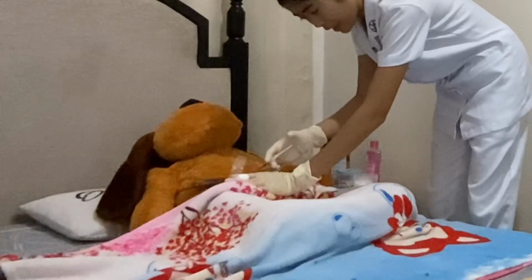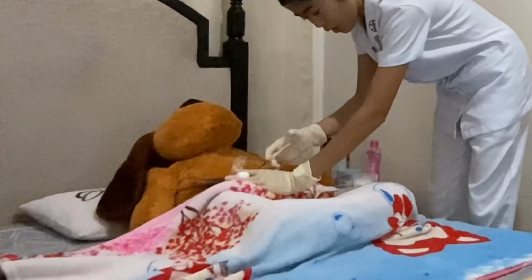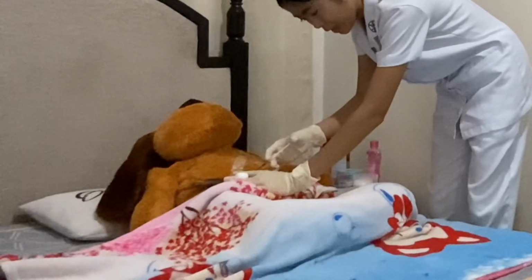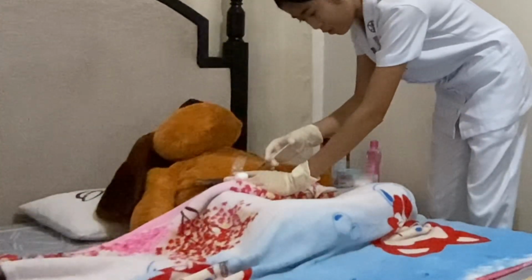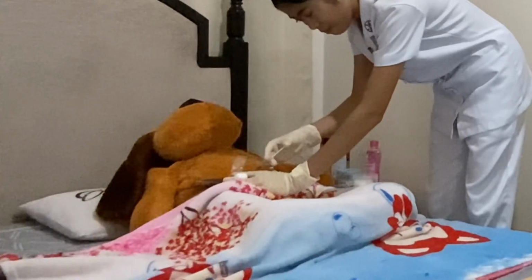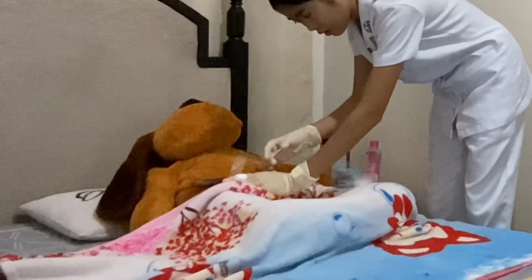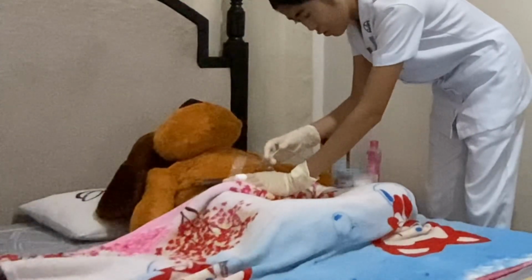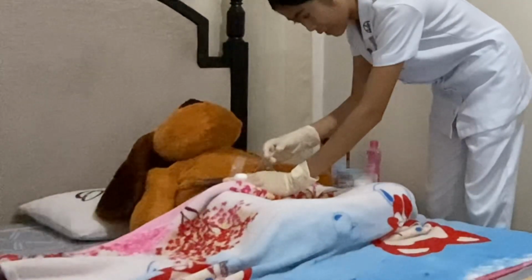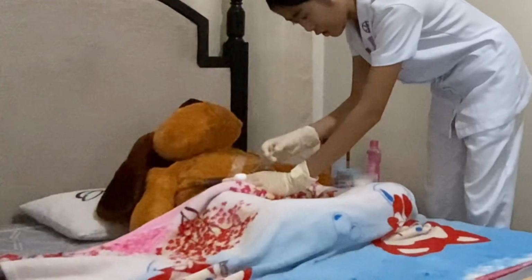And then, in order for you not to feel difficulty as we administer the medication, you can let go of the injection site, and then you hold the barrel with your non-dominant hand and hold the plunger using your dominant hand, and then you slowly administer the medication inside of the chosen injection site.